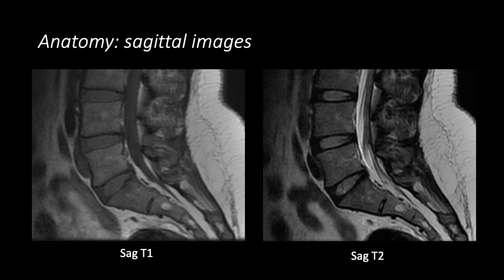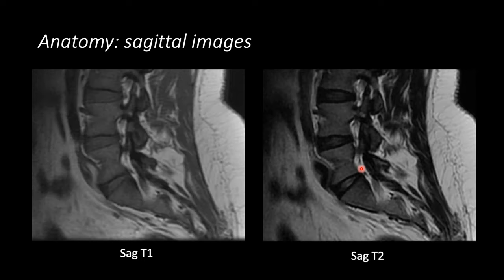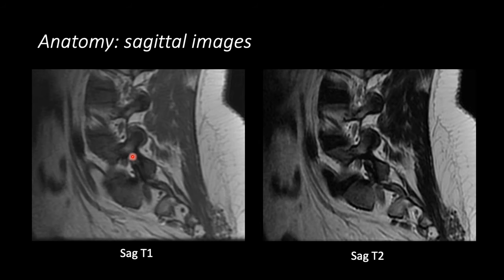Looking at the anatomy on the sagittal images, we're starting at a mid-sagittal section, and we can see the vertebral body. This is L5. This is S1. We can see the intervertebral disc and the epidural fat surrounding the thecal sac on this T1-weighted image. On the T2-weighted image, you can actually see the nerve roots, and as we move further laterally, we end up inside the neural foramen, where we can see the exiting nerve root as well as some small vessels in the foramen.